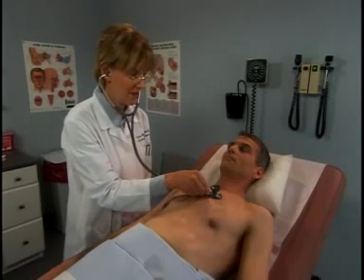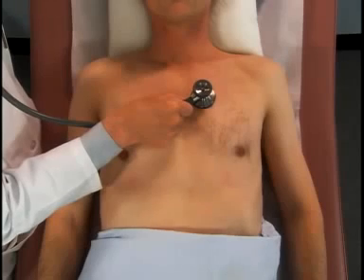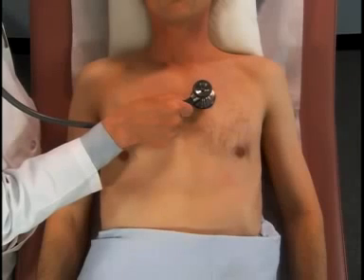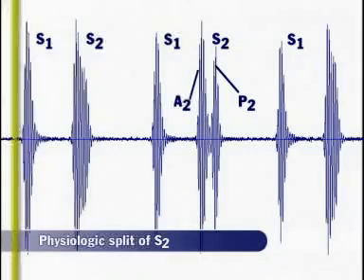Now breathe deeply. This physiologic split of S2A and S2P normally occurs during inspiration. During expiration, however, these 2 components are fused into a single sound, S2. Let's listen again.